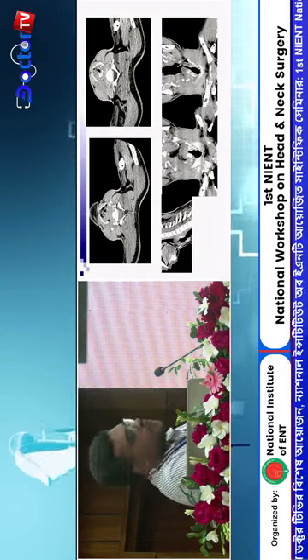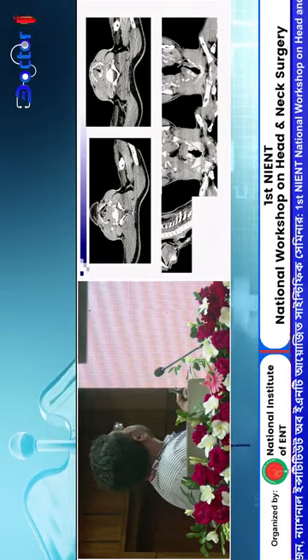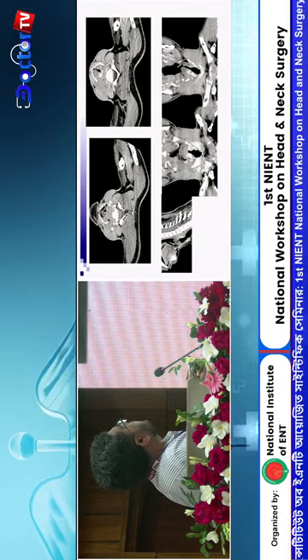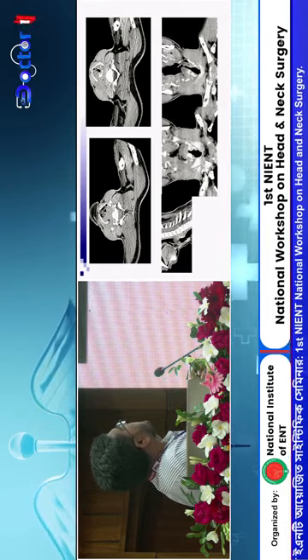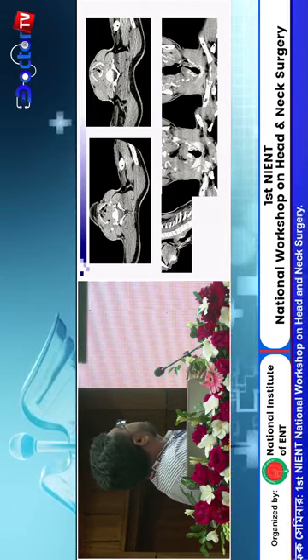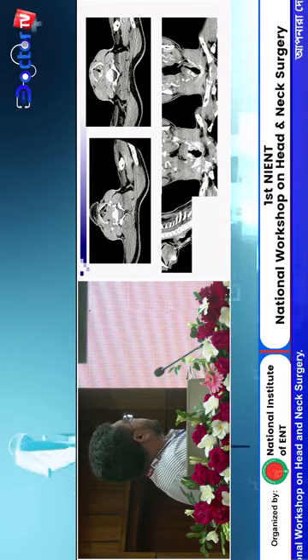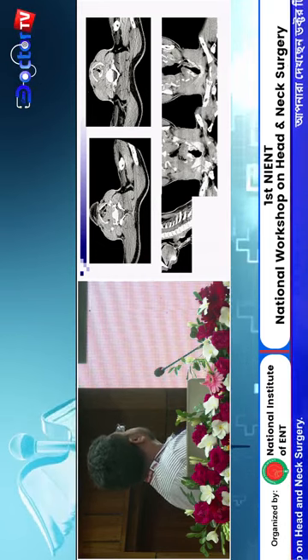And we go to the T4A tumor. There is a large tumor in the supraglottic, glottic region. There is gross erosion of the right thyroid cartilage and gross paralaryngeal extension. Here is the gross paralaryngeal extension and the right thyroid cartilage is eroded. This is a T4A tumor.